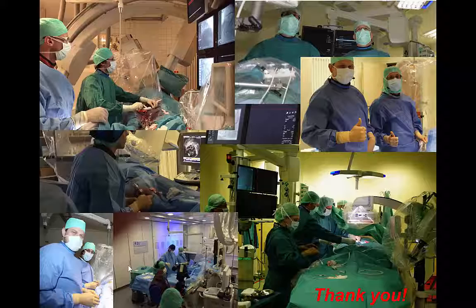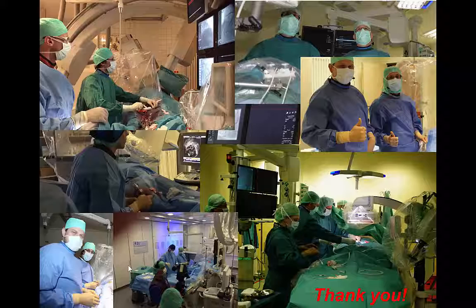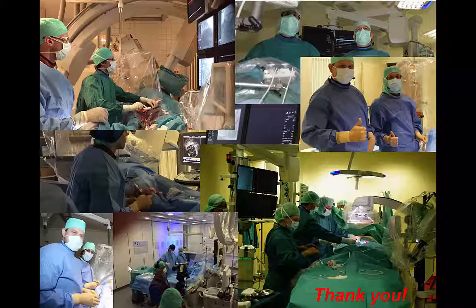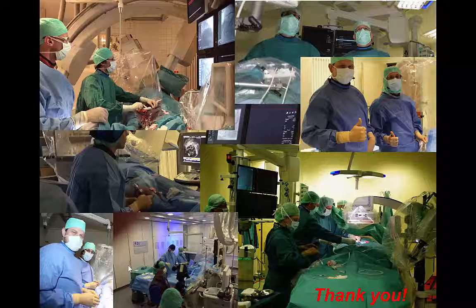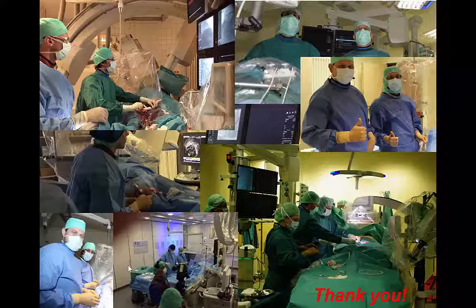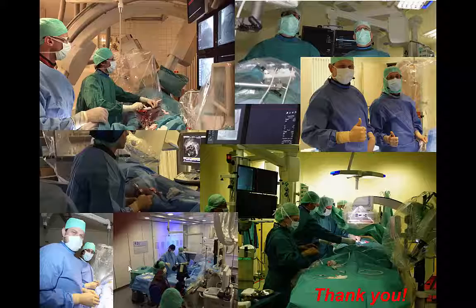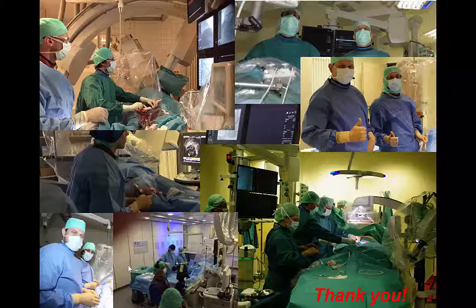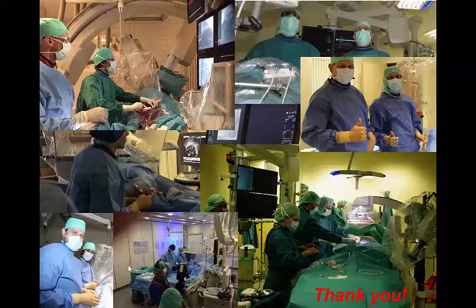Sometimes people are afraid when you have an epicardial or septal collateral that enters directly at the CTO distal cap. This is not the best situation, but it's also not the worst. When you can puncture retrograde and externalize your wire, then with the dual-lumen microcatheter nowadays, it's very easy to solve this problem. Thank you very much again for the excellent presentation.